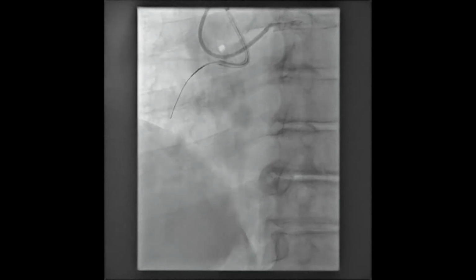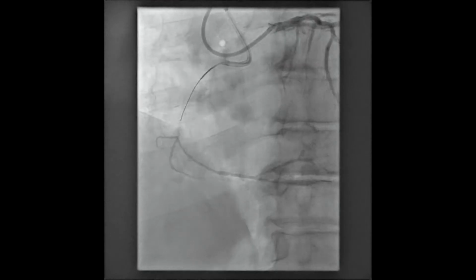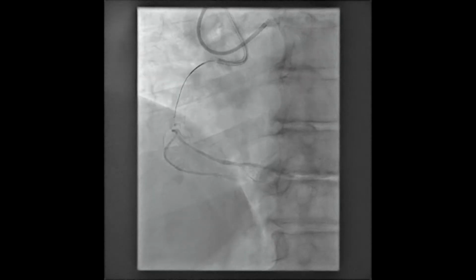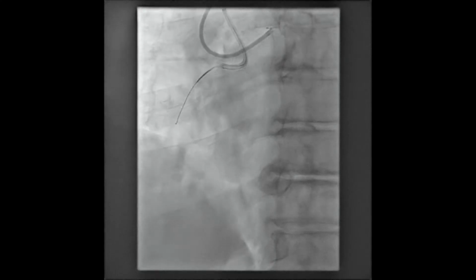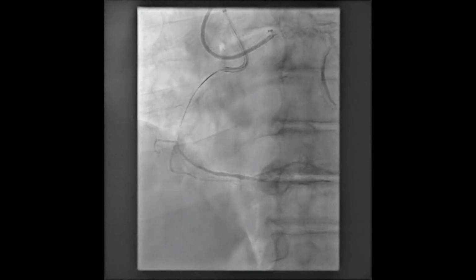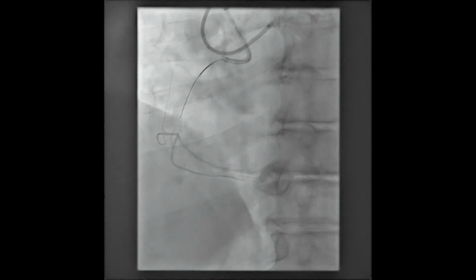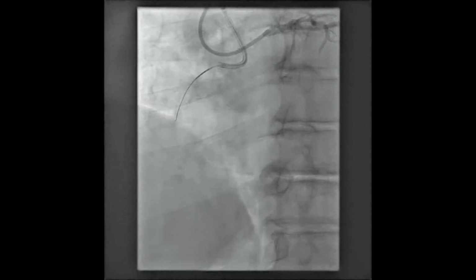And sometimes it works just well. We were able to get started without really any issue in an antegrade fashion. Retrograde injection we perform in order to make sure that we're headed the right direction. At some point during most of these cases, antegrade injection through the antegrade guide, in this case the 3D right, is not recommended. You've created a dissection flap, you're in extraplaque in a lot of the cases that you're doing, and injecting antegrade can tear the vessel and end the case prematurely.